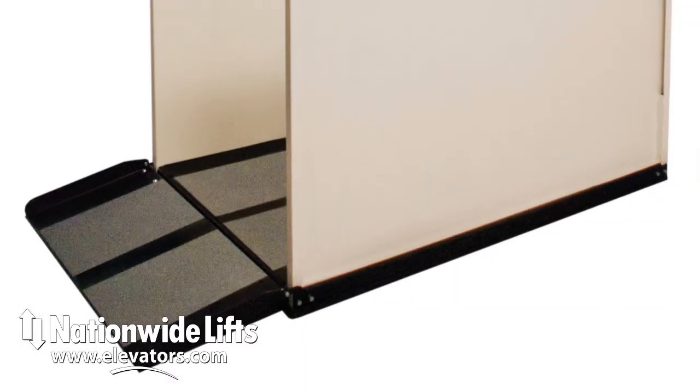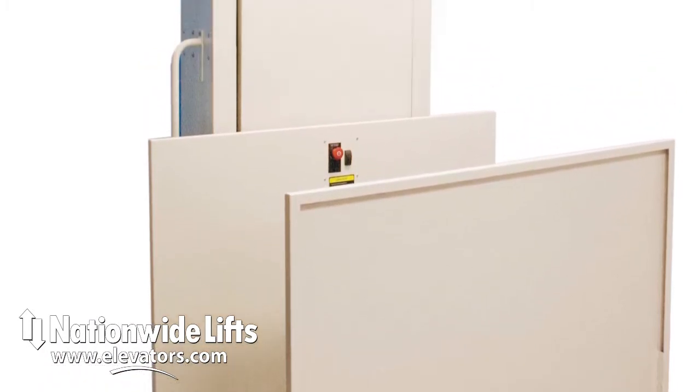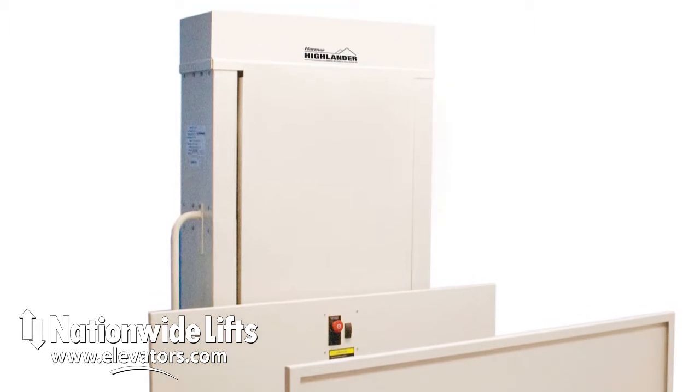The Apex Green by Nationwide Lifts is a wheelchair lift built for any environment. This can be installed in commercial or residential applications. Typically installed outdoors and in garages, it will handle extreme temperatures and harsh weather.